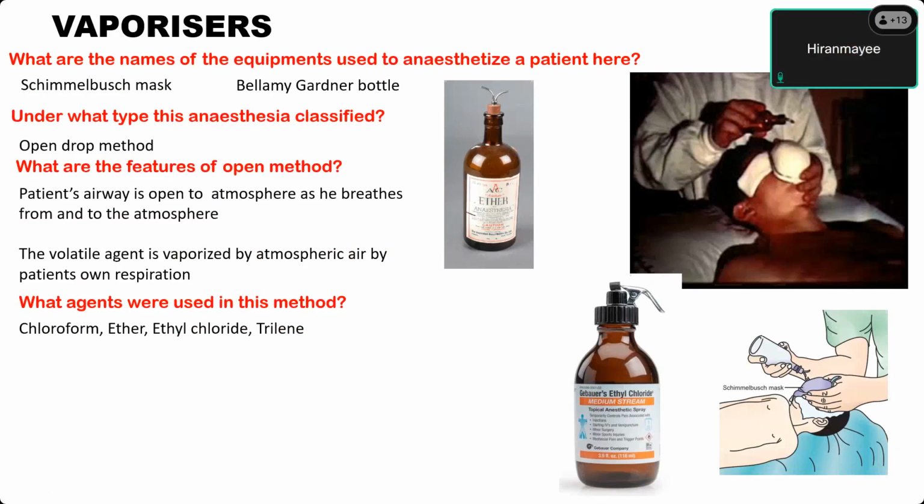16 degrees, sir. 15 degrees. Very good. So what state will the agent be present in, in the bottle? It will keep boiling at below room temperature itself. So what will happen? What will be the pressure inside? It will be at high pressure.